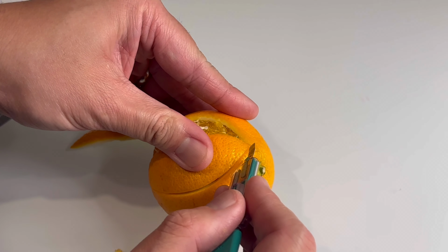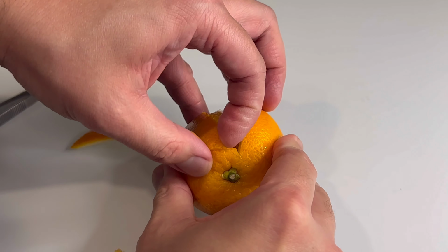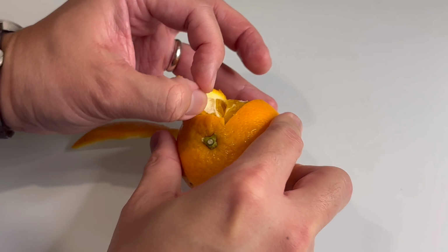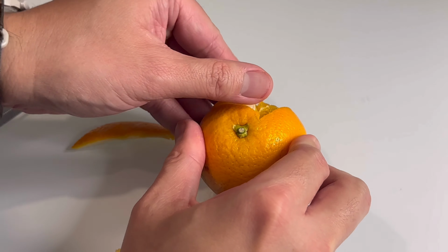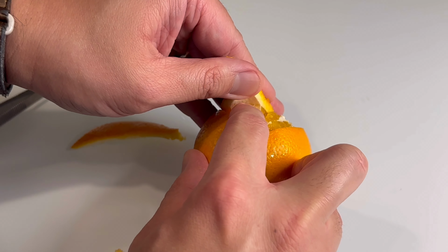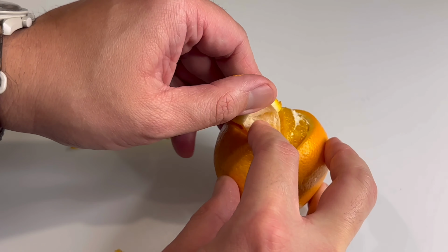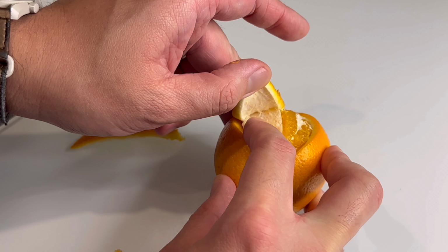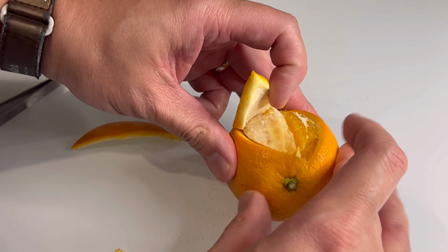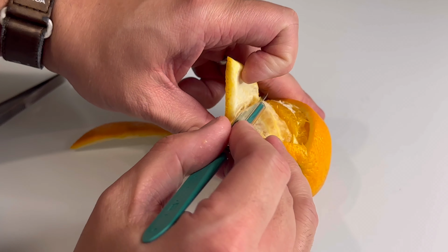So here now we've cut our other line of skin, and so when I lift this up, when we follow down the plane, you could see the plane there, and then we could either push it downward, see? And so when you're pushing it downward, the other hand retracts. So we can do that one, or we can, again, use the knife.